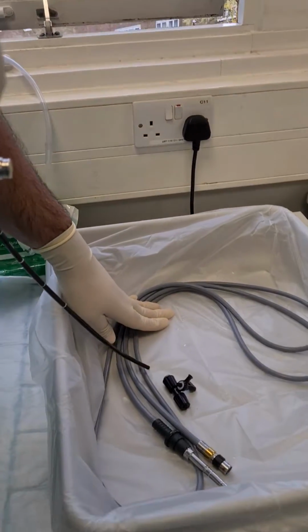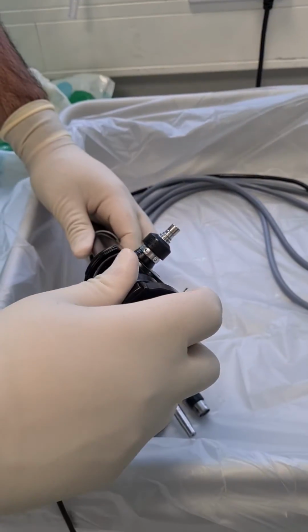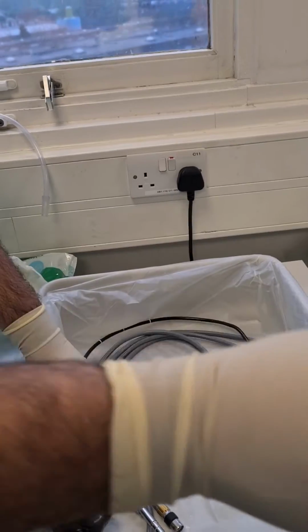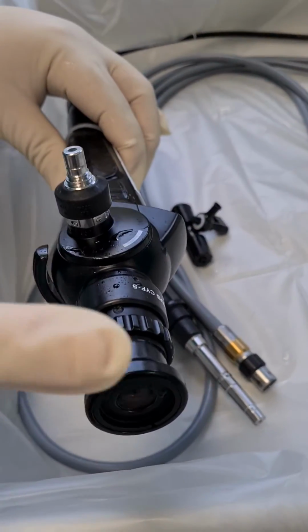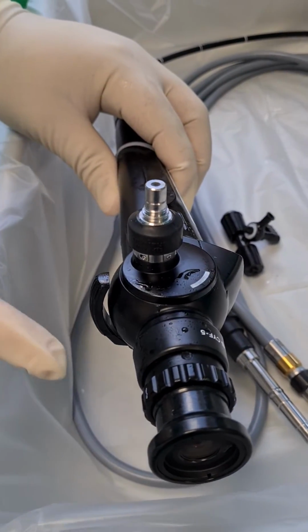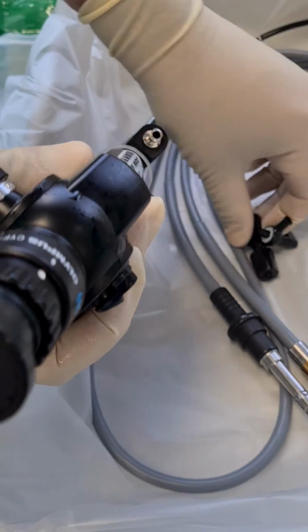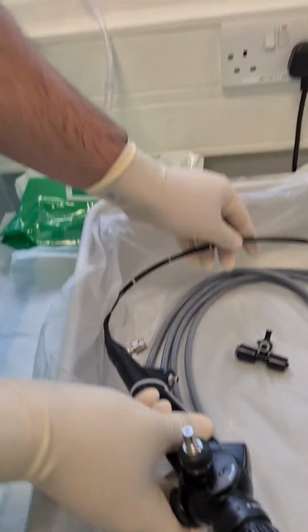This is the light source like anything else. So if I place it here, this is for the camera, the eyepiece, for the light source. The working channel will be here for the guide wire and removing forceps. And this is for the shaft.